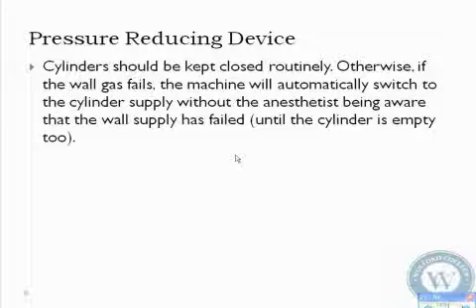Now, the new machines, the completely computerized machines, we have some of them. Those things are really awesome. They can be intimidating the first time you see them. The older machines look really simple, and they are. You've got everything you need sitting right there, but it's not a computer. With the computer, you've got to push buttons and everything to turn everything on, including the ventilator.